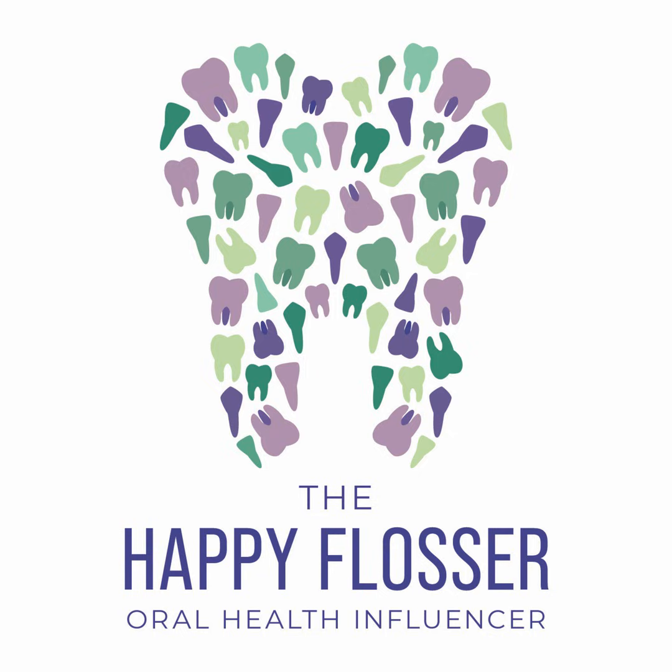Now, that's completely my strategy. That's how I tackle radiographic interpretation. That does not mean that's how you have to tackle radiographic interpretation. After I do that, I move on and start looking at existing restorations or the need for restorations. So I'm going to look through the mouth at the current amalgams, make sure there are no overhangs or suspicious density changes around that restoration.